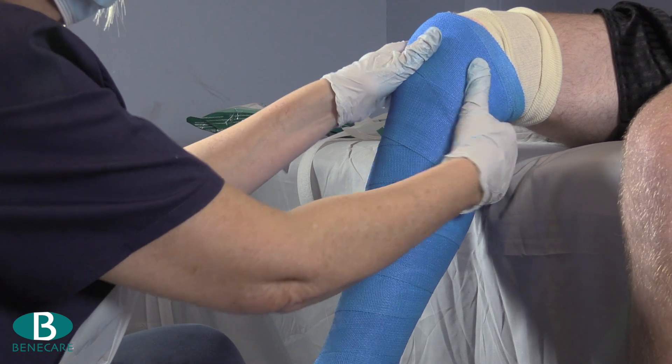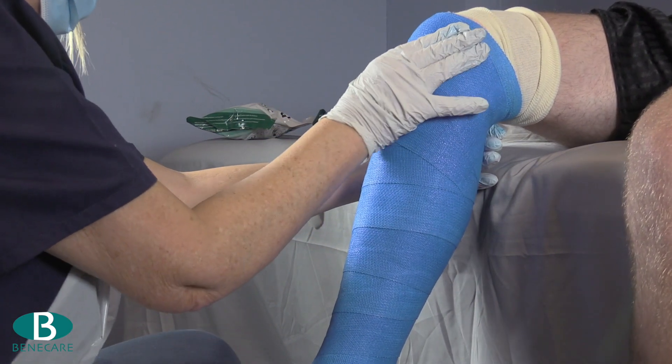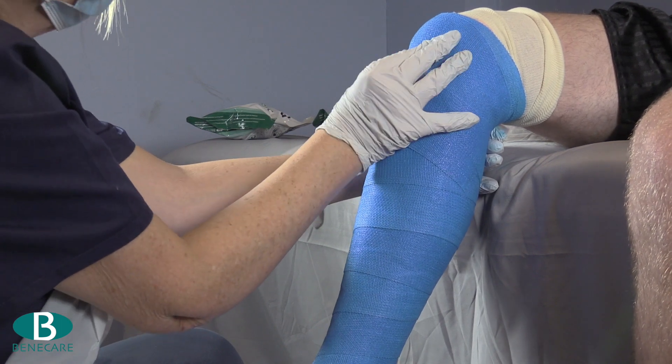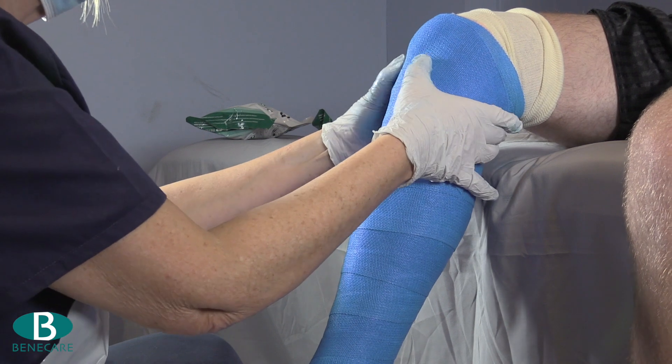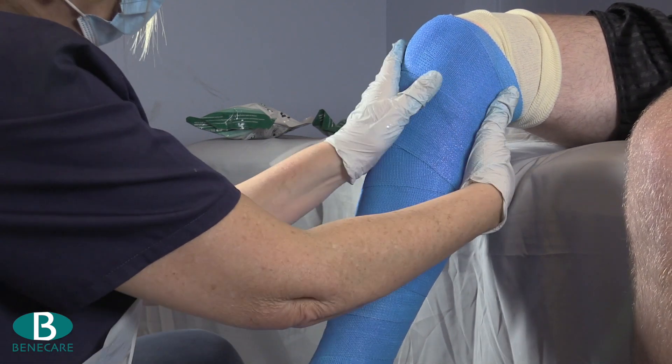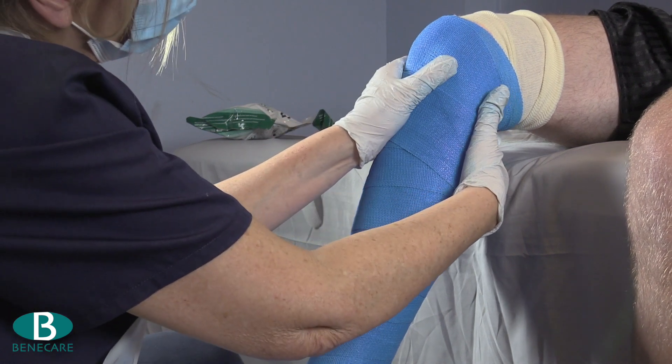Mould the cast to ensure it is fitted to the contours of the limb and has excellent lamination. Pay particular attention moulding into the patella tendon at the base of the patella and flatten the cast on the posterior aspect behind the knee.